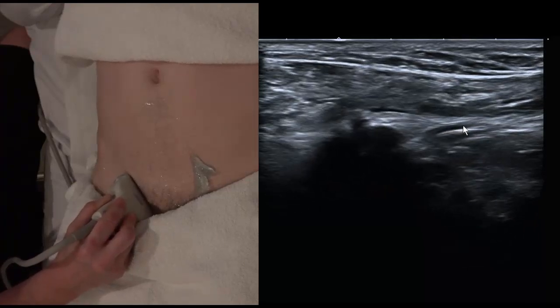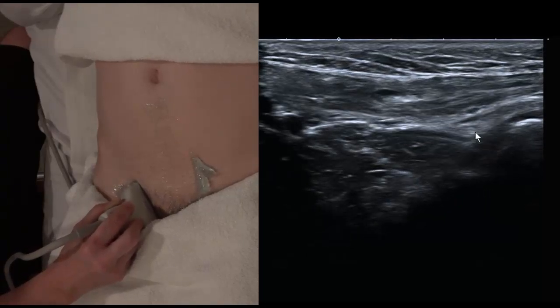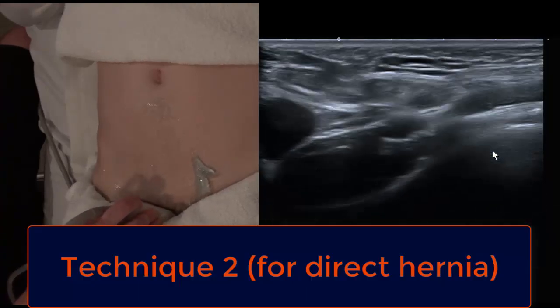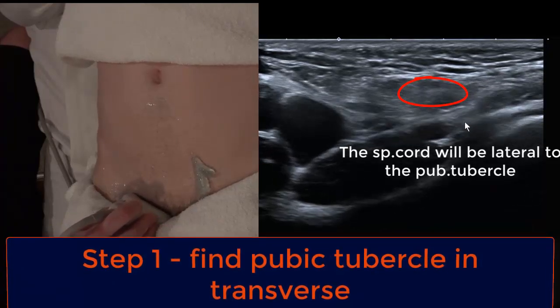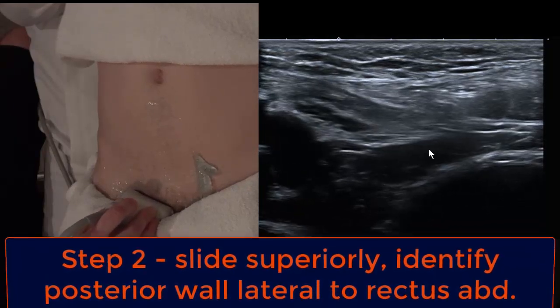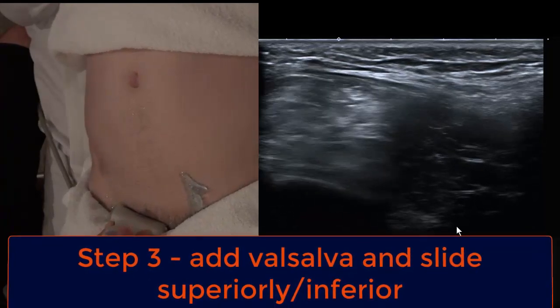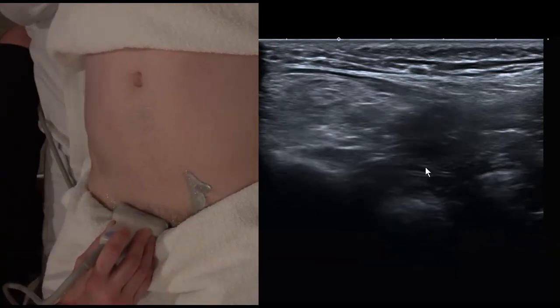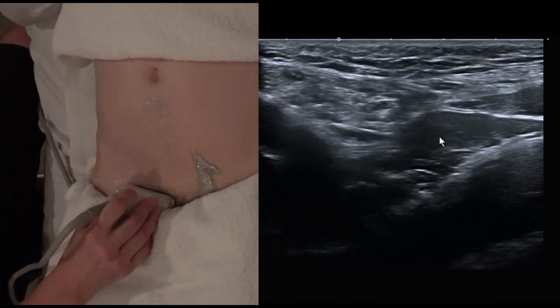Following that echogenic line — that's the posterior wall of the inguinal canal — that's where your direct hernias can bust out. In transverse, identify the spermatic cord and the posterior wall, then move the probe slightly superiorly, keeping your eye on the deep side of the spermatic cord. Now ask the patient to strain. Ignoring the movement to the left, you can see a bulge has occurred in the region of Hesselbach's triangle, but we expect intra-abdominal pressure to increase and cause the abdominal wall layers to bulge out.